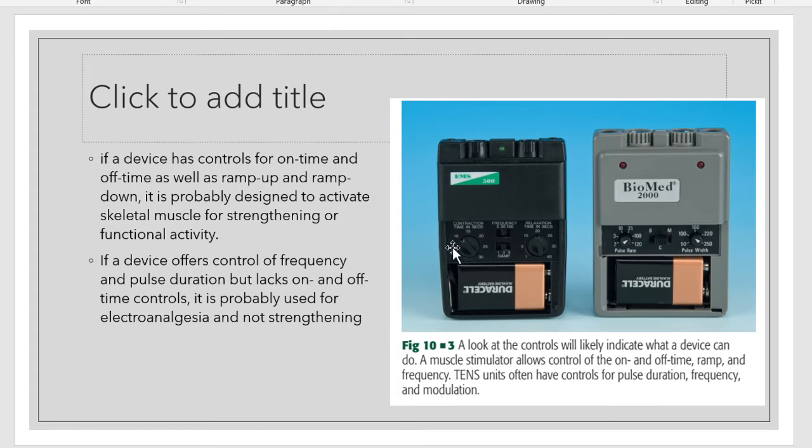It's very important for you to look at the controls of your modalities and analyze whether it is for stimulation or for analgesia, for pain relief or pain control. At the same time, you can try to test it on yourself.